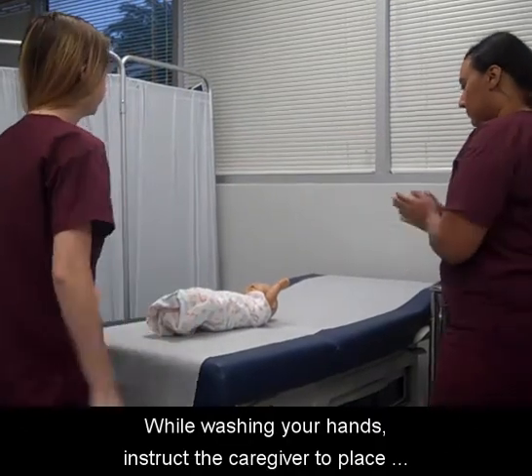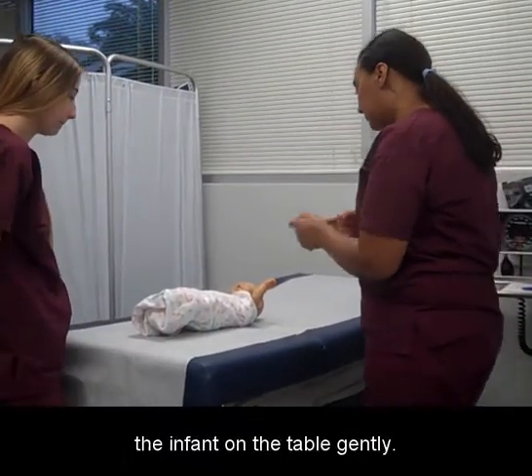While washing your hands, instruct the caregiver to place the infant on the table gently.